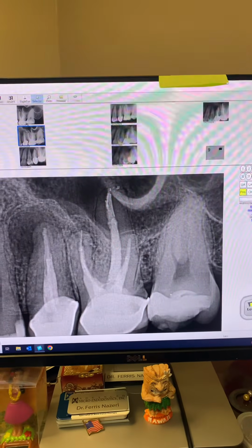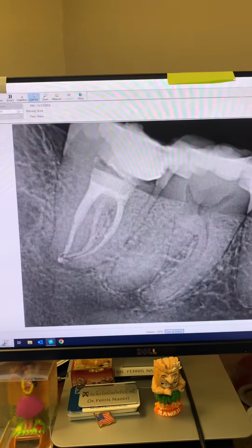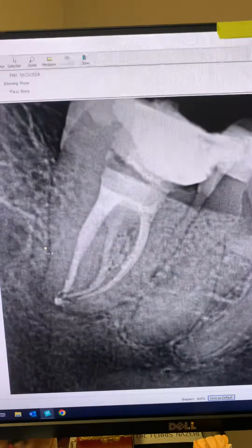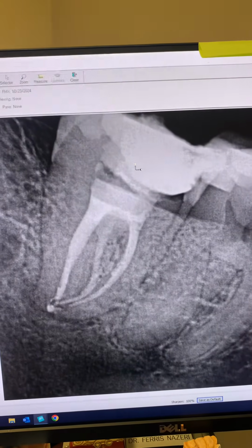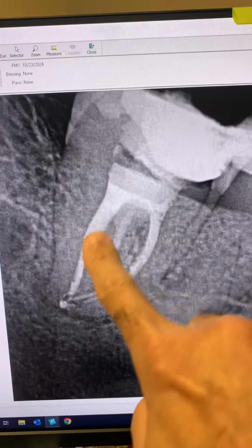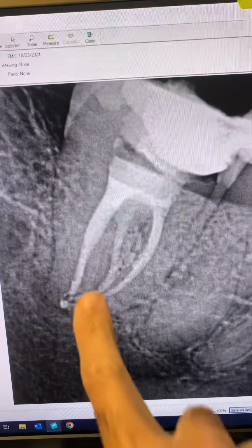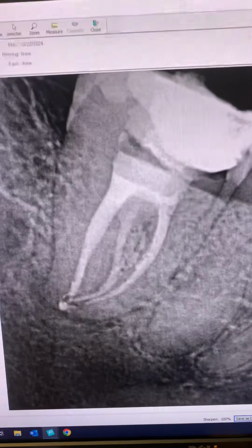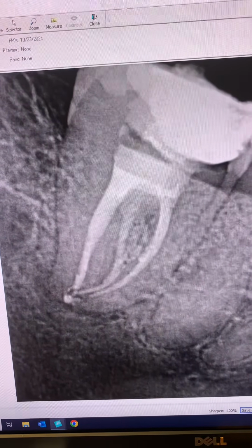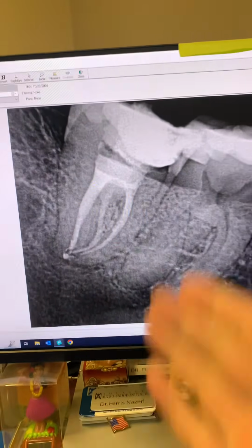And let's look at the final results of tooth number 31 that we just completed the root canal on. So as you can see, everything went beautifully. This was a C-shaped tooth. Two mesials, one distal, and look at all of this anastomosis between the mesial canals, and look at all of that beautiful anatomy in the apical area of the root canals of this tooth. As you can see, everything went great.